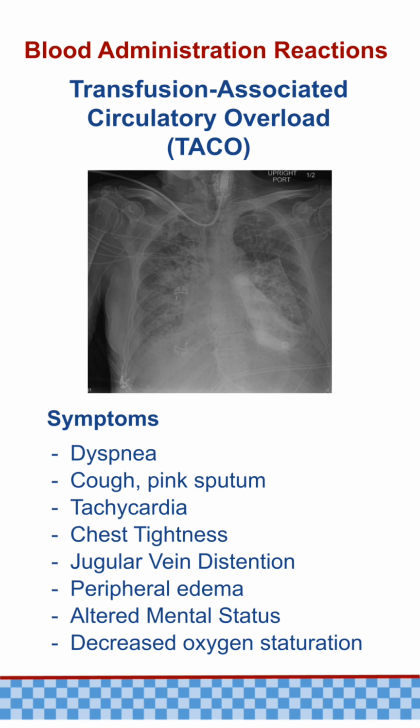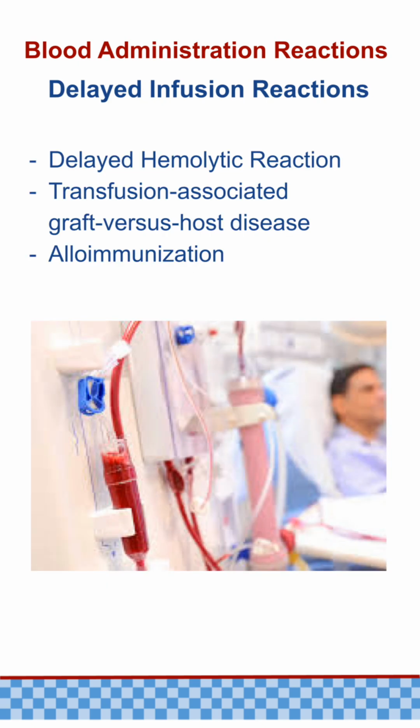If you see any signs of transfusion-associated circulatory overload, pause the blood infusion and immediately contact medical command for further direction on patient management. Be prepared to support oxygenation by providing high-concentration oxygen. Closely monitor vital signs and observe for changes in the patient's condition.